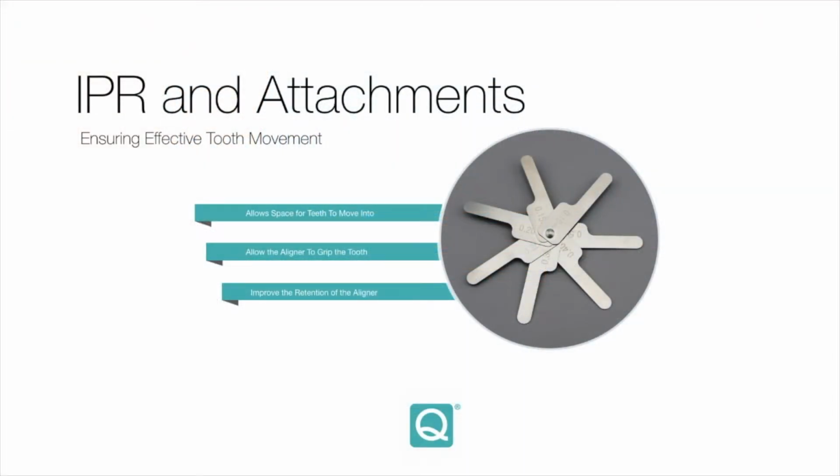Attachments let the aligners grip onto the teeth more effectively, and they also improve the retention of the aligner, improving patient comfort and ultimately improving the way the teeth track and the treatment outcome as well.